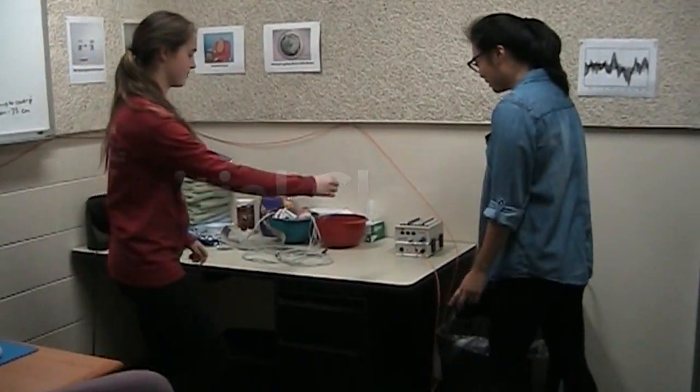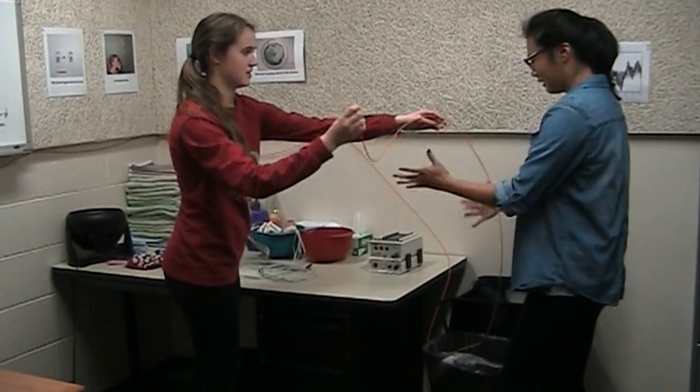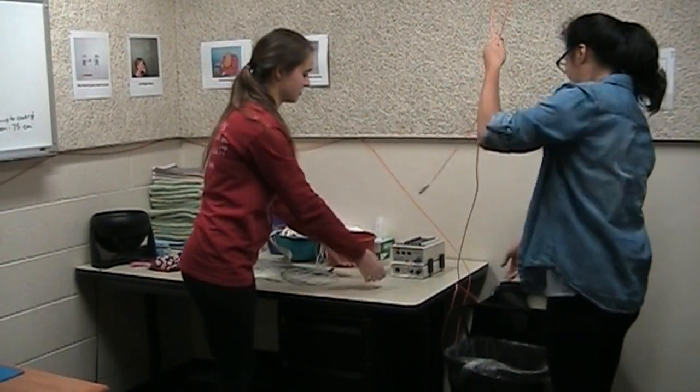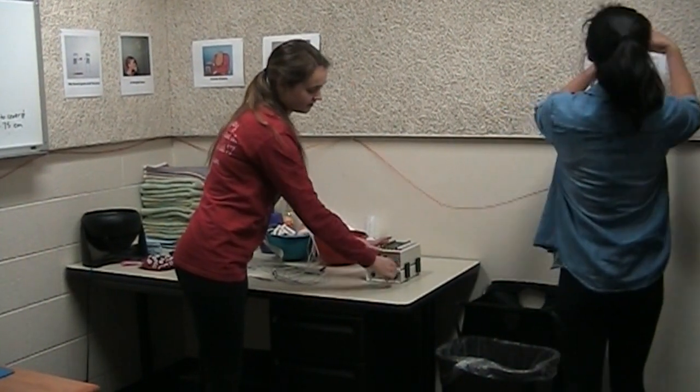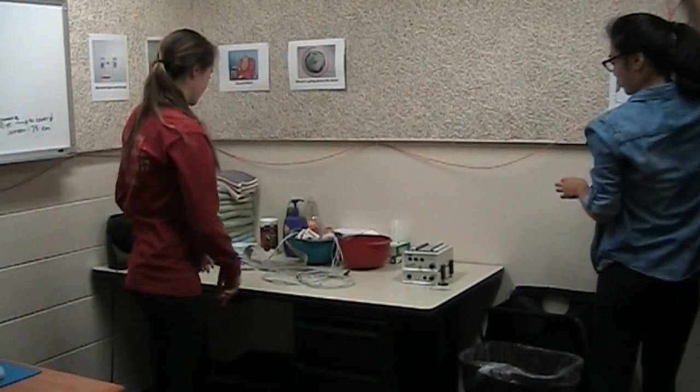And then, so we unplug the orange cable from the sensor box, and Michelle's going to hang that up on the wall. And then I just make sure that the battery's off, and I usually unplug the connection there.